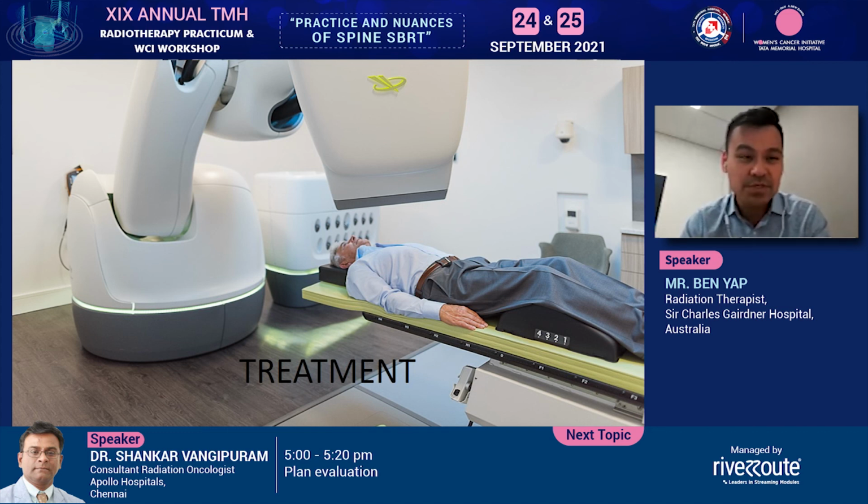If, however, it was like an intramedullary target or a very, very posterior target, that means very adjacent to the spinal cord or the esophagus, I would probably keep my imaging intervals quite short, just to ensure accuracy and for the robot to correct for any slight movements.